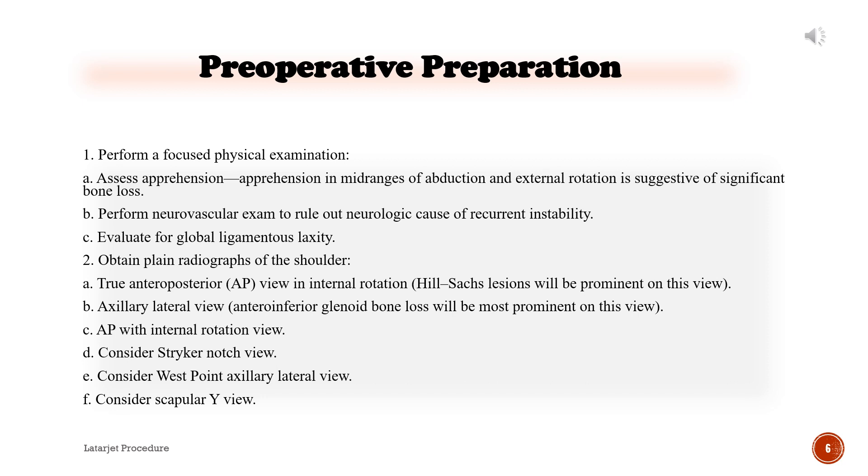Obtain plain radiographs of the shoulder. A. True anteroposterior (AP) view in internal rotation — Hill-Sachs lesions will be prominent on this view. B. Axillary lateral view — antero-inferior glenoid bone loss will be most prominent on this view. C. AP with internal rotation view. D. Consider Stryker notch view. E. Consider West Point axillary lateral view. F. Consider scapular Y view.